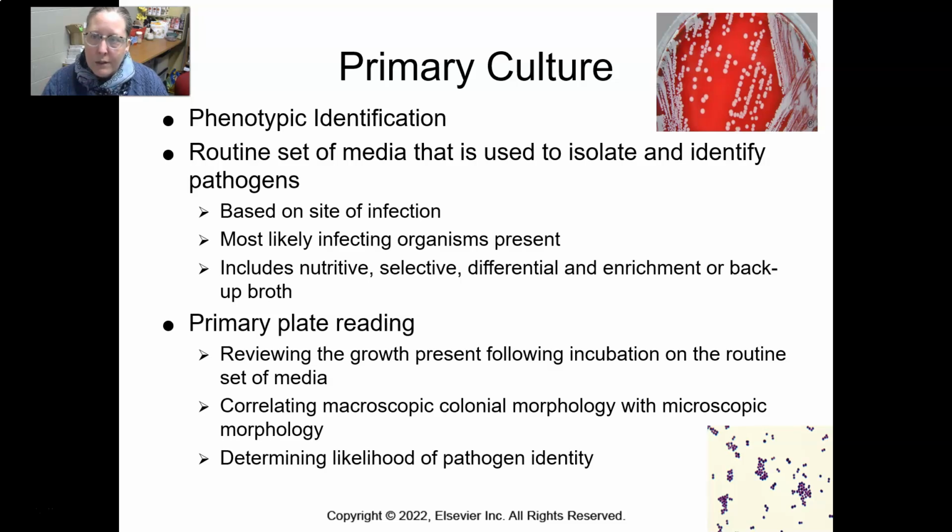The molecular stuff has only really been on the scene for, I would say, a few years, 10 years probably at the most, like really actively being used. And so it's a routine set of media that is used usually to isolate and identify pathogens. I'm sure each lab has its own protocol set, but there are things that are pretty standard.